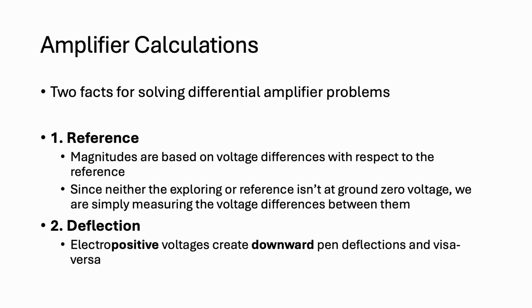It's all the extra stuff that's happening in the brain. But because it's on a bone and not on a brain part, it's relatively non-active. So when I say 0.0, that's not the voltage. That's just it's acting as a baseline. And that reference voltage changes, as you can see here. And that's just how electricity works. The explorer is really all the signal we're reading, but only if we get there by comparing it to the reference electrode.